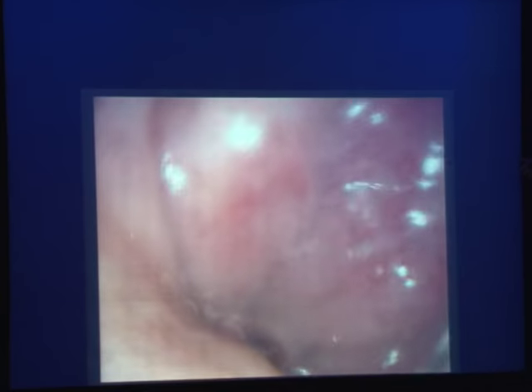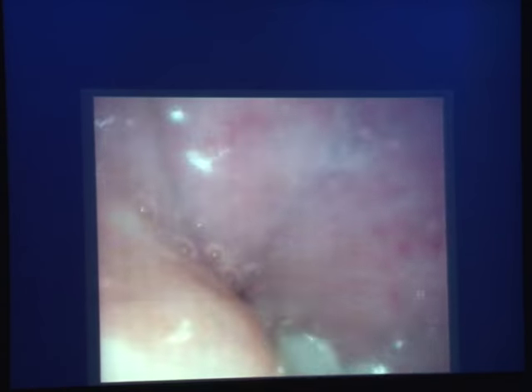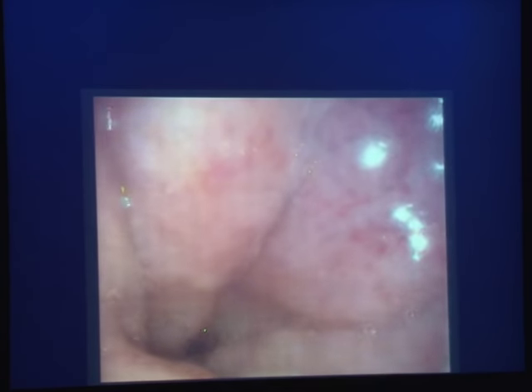Now this apnea is counted as 2 because a little air has gone in. But you can see that the desaturation is still happening. This little air was not enough. Now he has taken a deep breath.